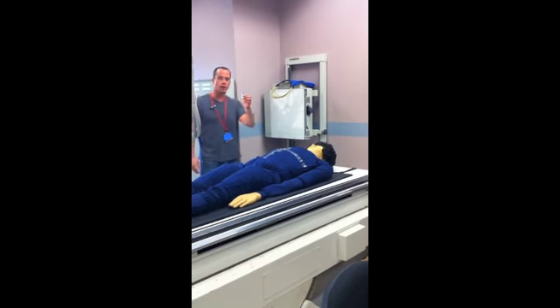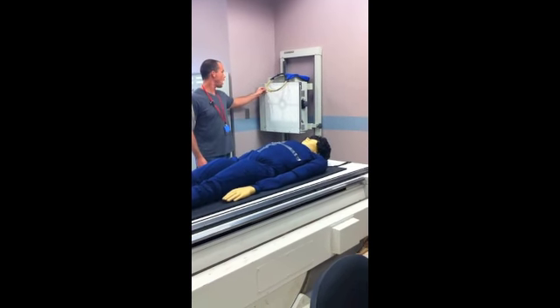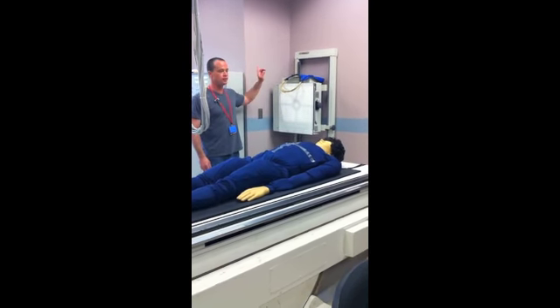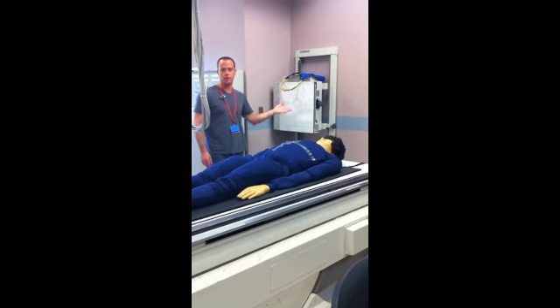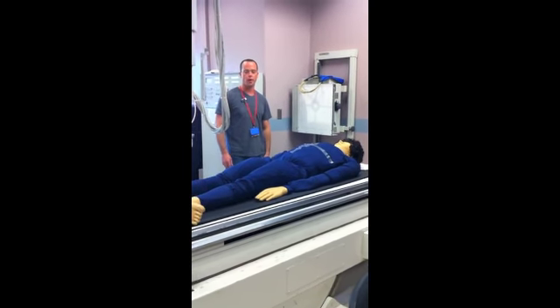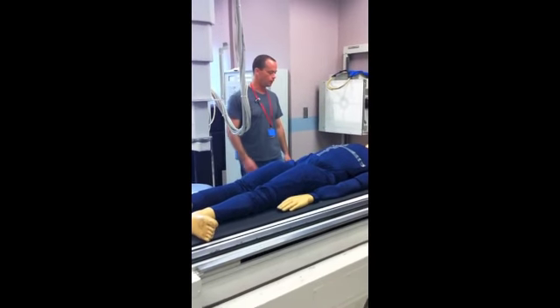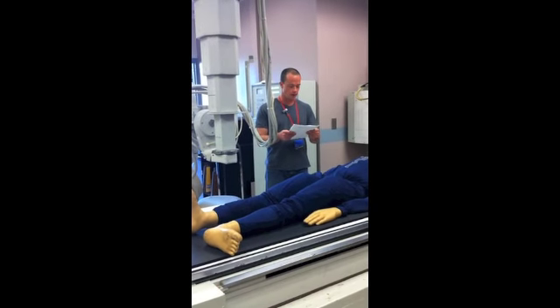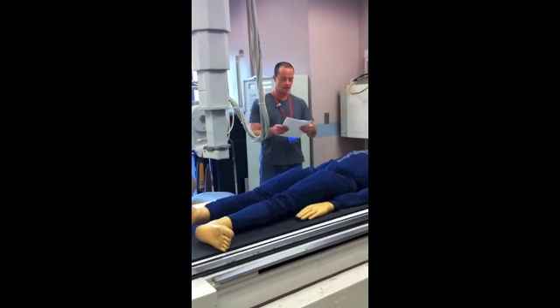I like to put my marker in the upper left, out of the patient's anatomy, making sure the marker is facing away from me so it shows up the right way, the correct way, when the computer brings it up.